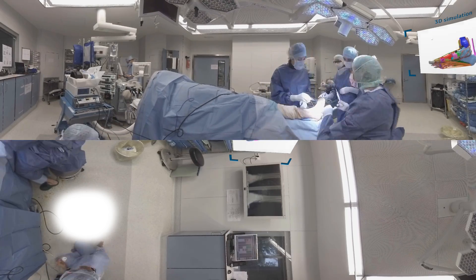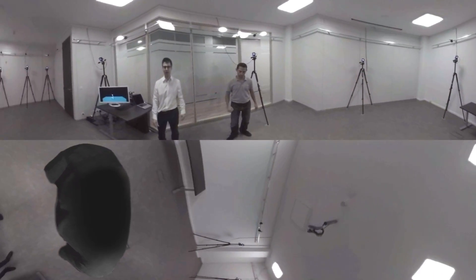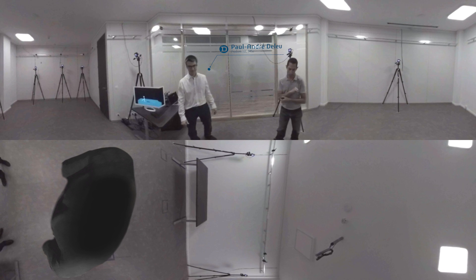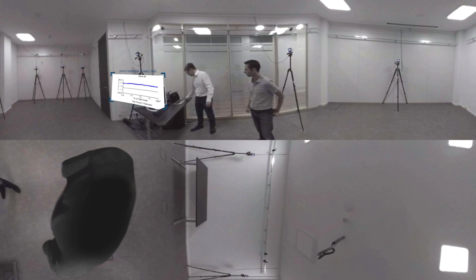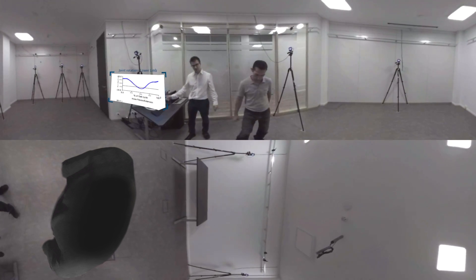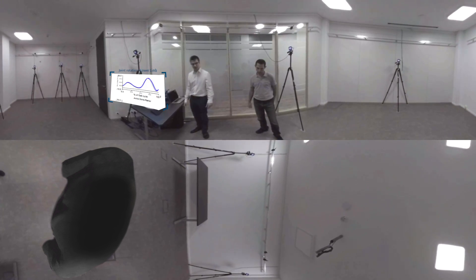Let's now evaluate the effectiveness of the surgery with a gait analysis in order to check if the simulated results correspond to the actual reality. Do the results match what the 3D simulation predicted? Yes. As you can observe, we have a perfect symmetry between the left and the right side, so the main objective of this procedure was achieved.